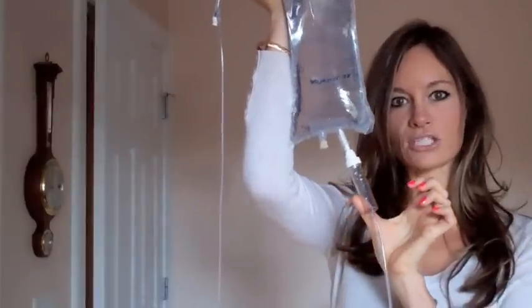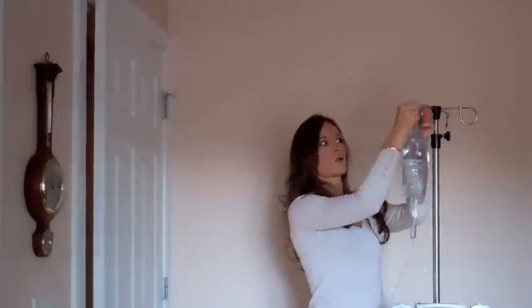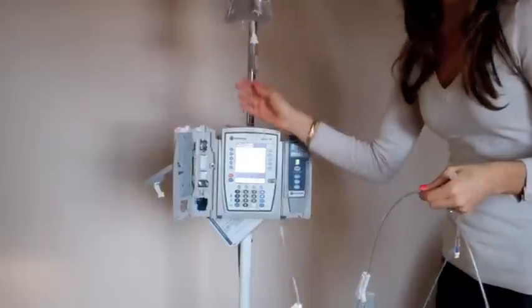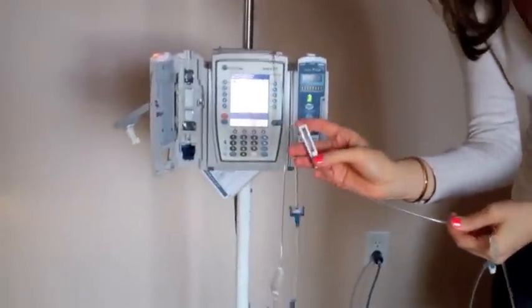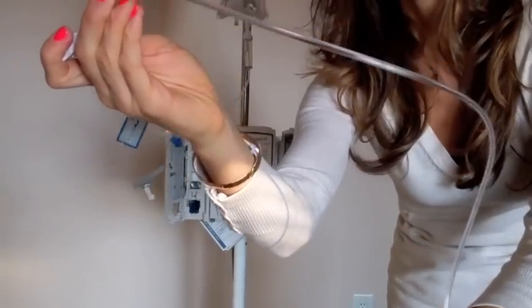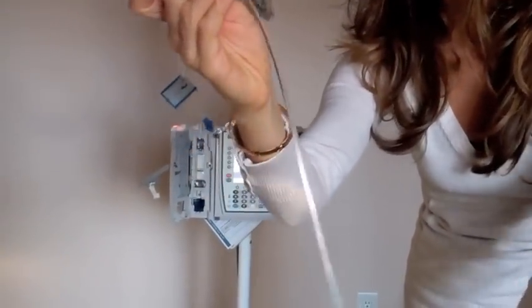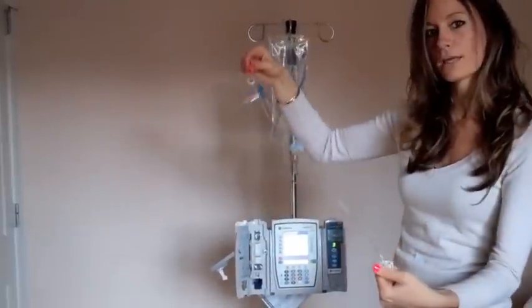Then you want to prime this chamber — all you have to do is squeeze it. Then go ahead and push this up here. To prime the tubing, we just have to open the clamp. You can see how the fluid is going. Make sure that there are no bubbles at all. Once you have that, lock it.